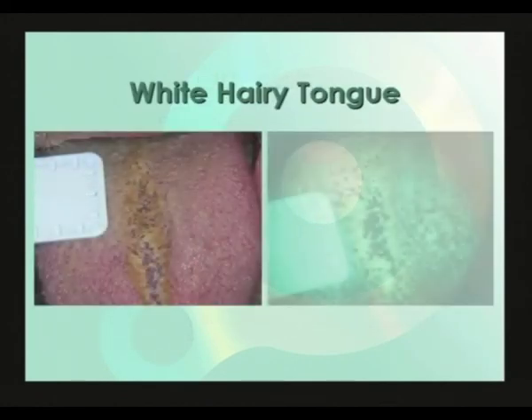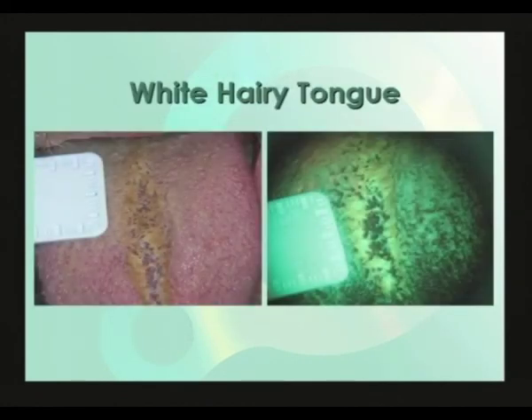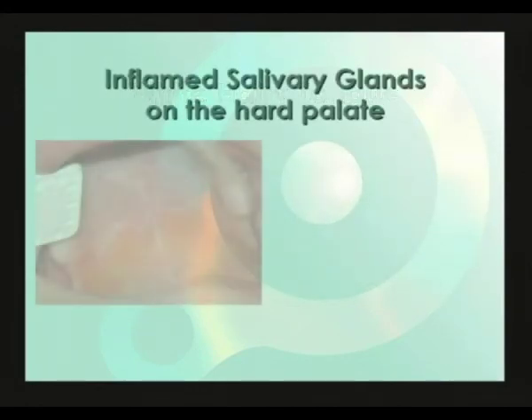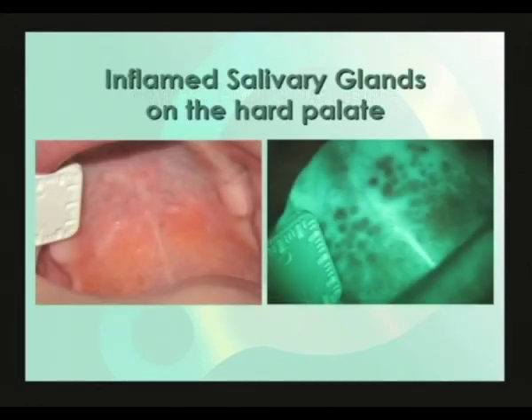Here is an example of so-called white hairy tongue — the extra-long keratinized filiform papilla show up very brightly under VELscope, as we would expect. These inflamed salivary glands on the hard palate of this patient show up as little dark patches under VELscope, as we would expect from our discussion on inflammation.